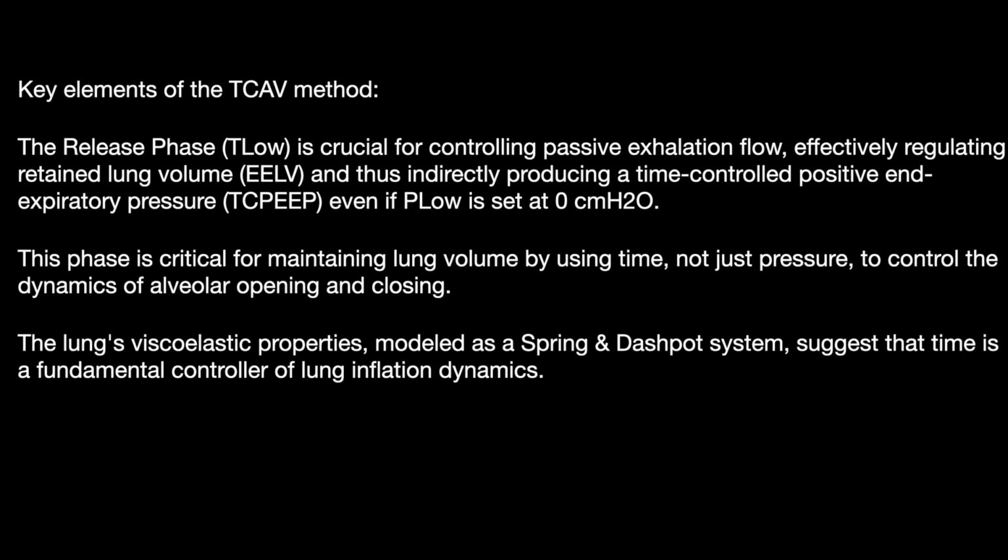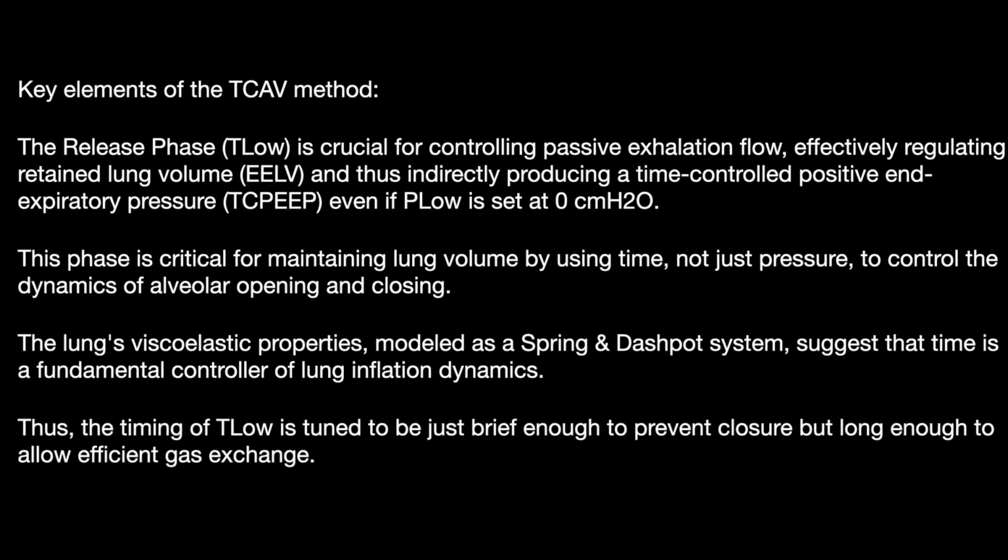And the lung's viscoelastic properties, modeled as a spring and dashpot system, suggest that time is a fundamental controller of lung inflation dynamics. Thus, the timing of the T low is tuned to be just brief enough to prevent closure, but long enough to allow efficient gas exchange.